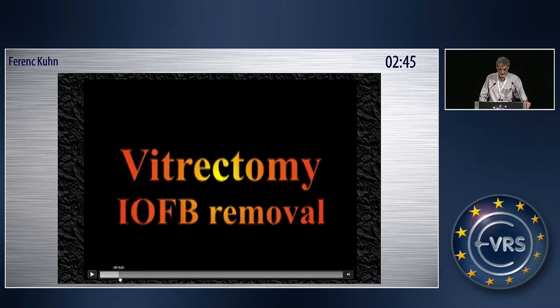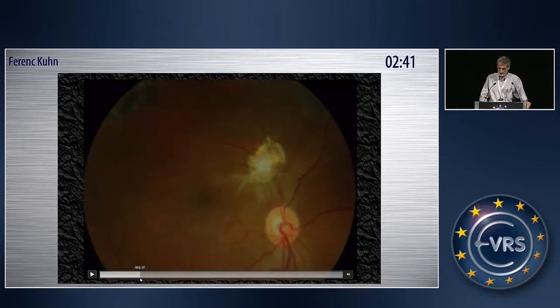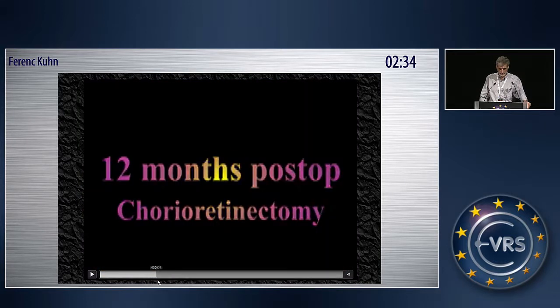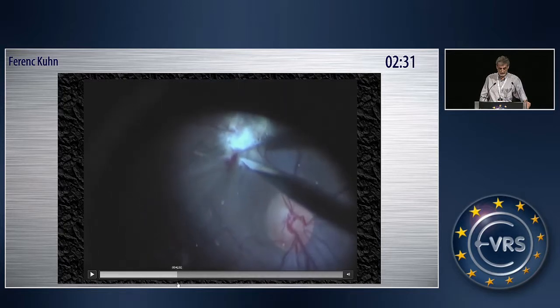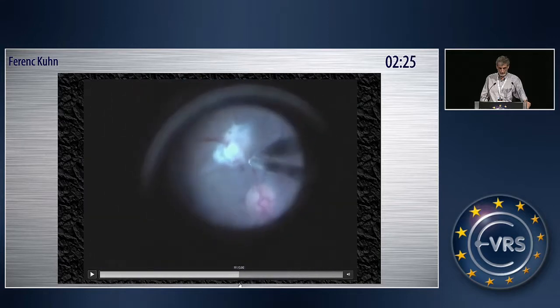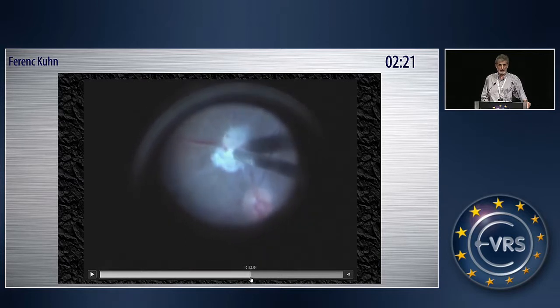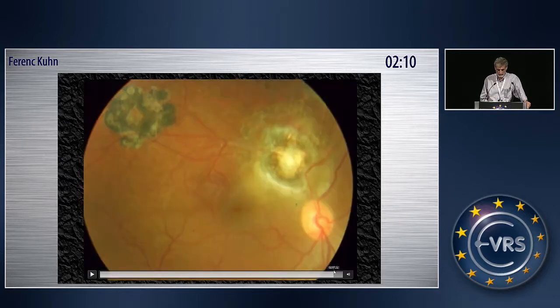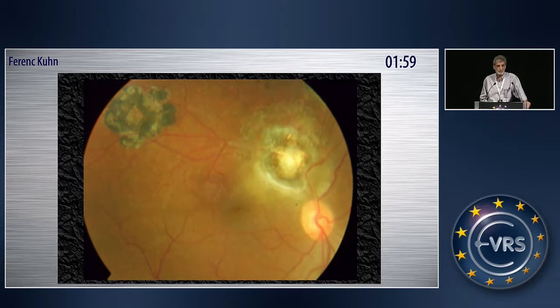Here is a case with a deep retinal impact caused by a foreign body, which was treated the traditional way — you take the foreign body and then you do laser. The problem is you have these folds and the patient's vision drops dramatically. The option you have is either accept it or do a chorioretinectomy. You essentially do the same thing: you burn the retina and the choroid. This is a fairly old video — I would not do laser today because there is no traction left. There is no vitreous, and doing the laser increases the scotoma, so I would leave this without any laser today.